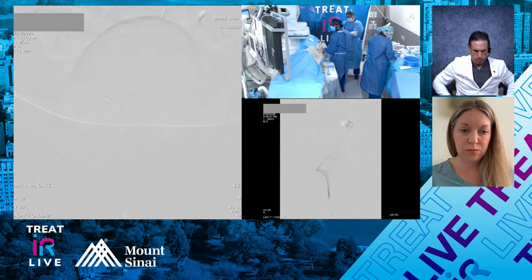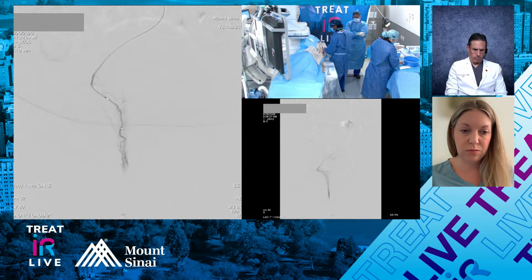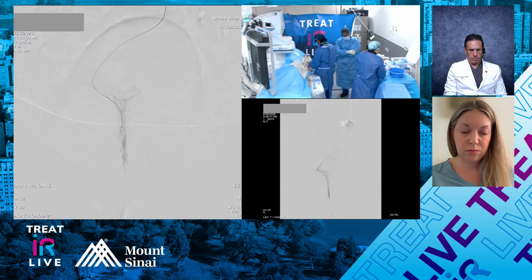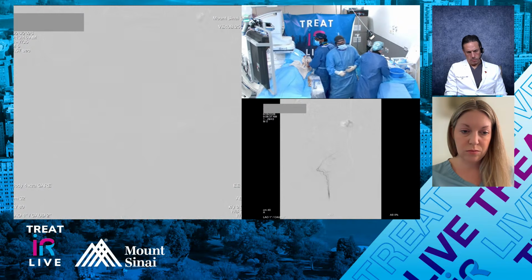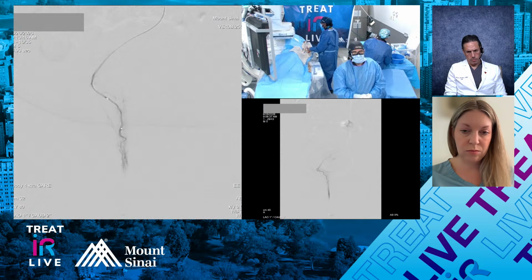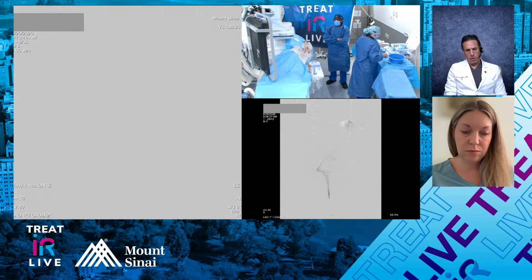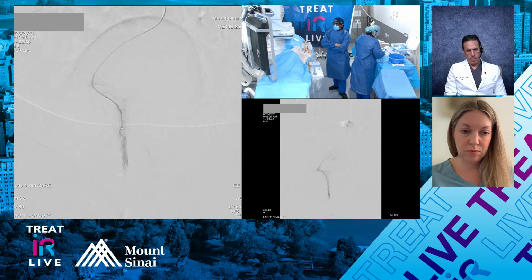I personally use the soft coils from the Bolt. I find that they work well. I just find these vessels to be very sensitive, and when I was trying the fibered ones, I was not comfortable with the placement of them at times. So I've switched to the soft coils, and I call them the J coil sometimes for this purpose.